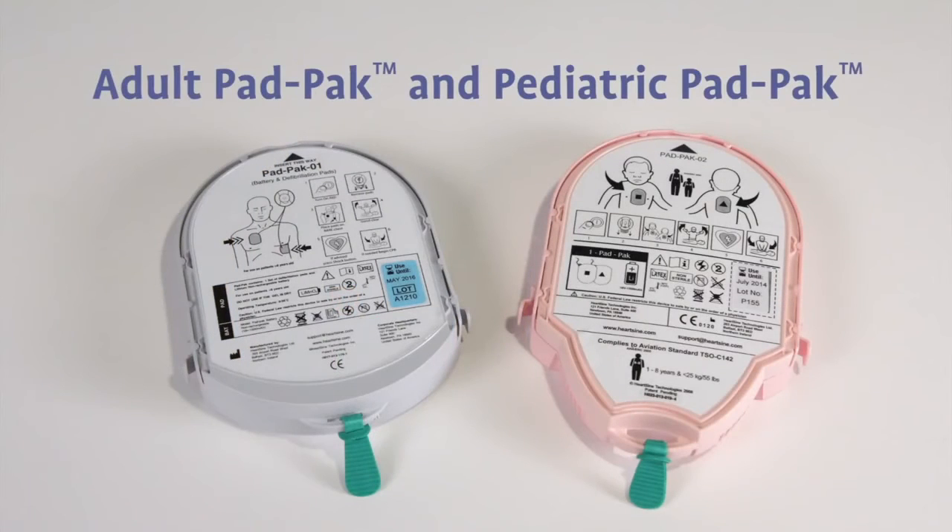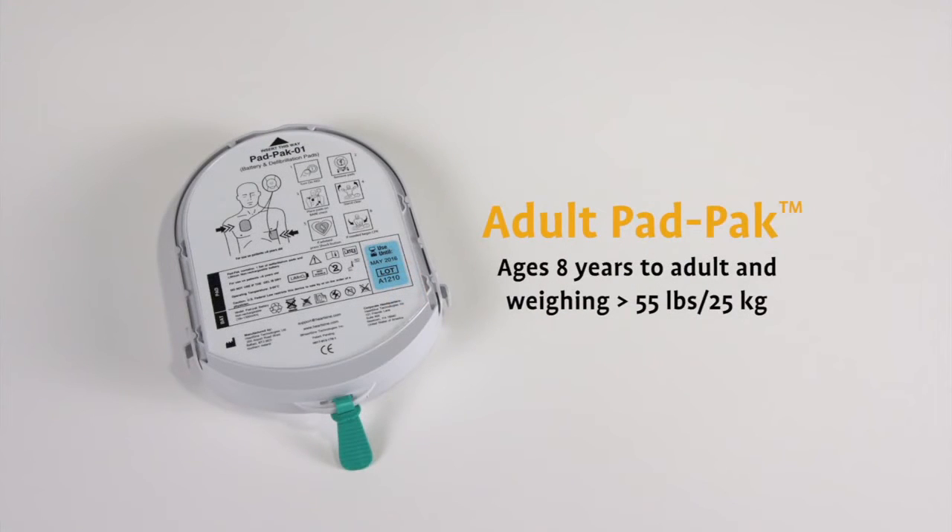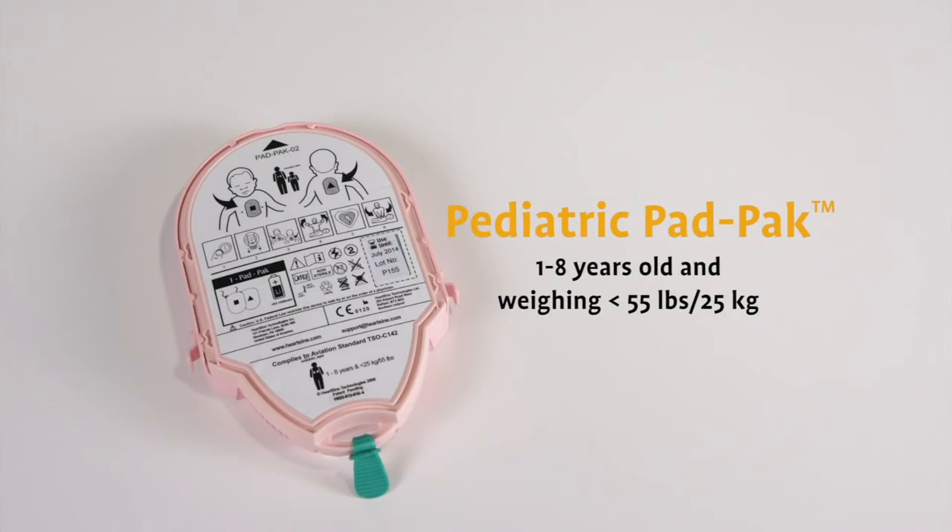Pad packs are available in two versions: one for adults and one for children. The adult pad pack is for patients over 8 years old and weighing more than 55 pounds or 25 kilograms. The pediatric pad pack is for children between 1 to 8 years old and weighing less than 55 pounds or 25 kilograms.